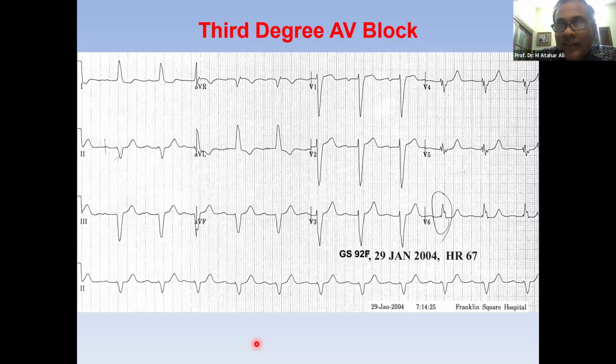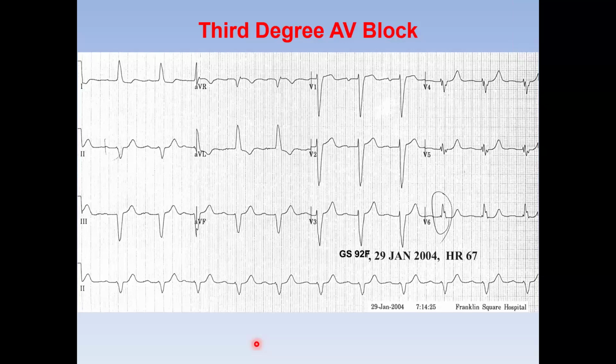Sir, one more question, sir. Is there any consideration if the sleeping heart rate in complete heart block, as Dr. Mohsin was telling, is below 40? During sleep, there is a complete heart block, but what is the junctional or escape rhythm that happens during sleep? This is the junction, QRS complex not wide, narrow. So what was the rate at sleep? If it is very low, 35 or 36 or even 30, does it justify it in a different way, sir?